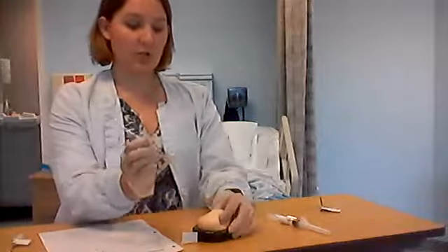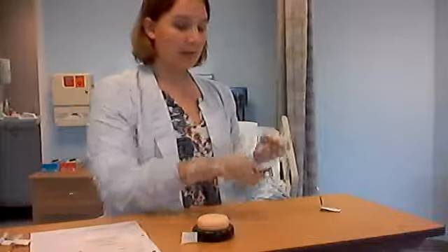So I pinch, I poke, I release, I kind of walk my fingers back up, and I inject slowly. And then I take the needle out. This does not have a safety device on it, so it goes directly into the sharps container. Okay? I instruct my patient not to touch it, massage it, rub it, leave it alone. If he has any issues, to let me know. Okay? My last injection, my IM injection.